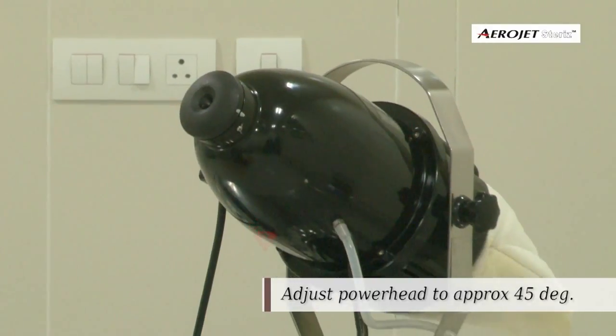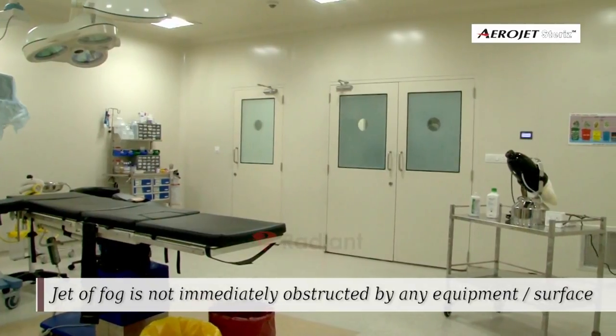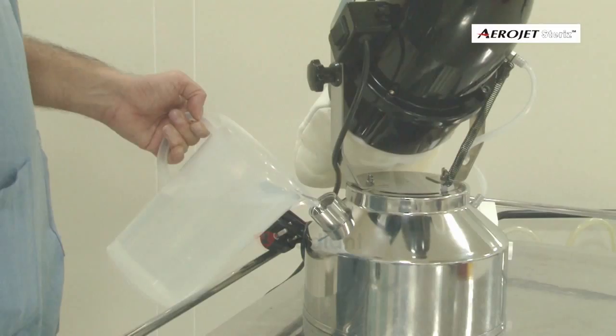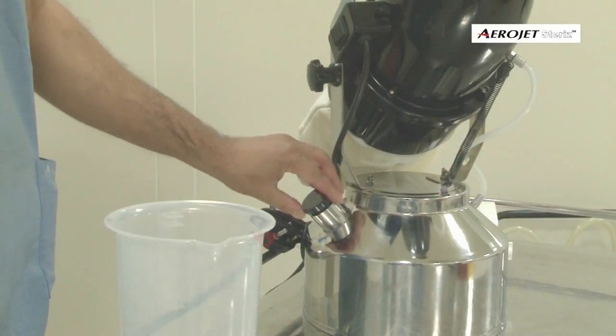Adjust the power head to approximately 45 degrees into the room. While placing the machine in the room, make sure the jet of fog is not immediately obstructed by any equipment or surface. Fill the measured disinfectant solution into the tank and close the tank lid.